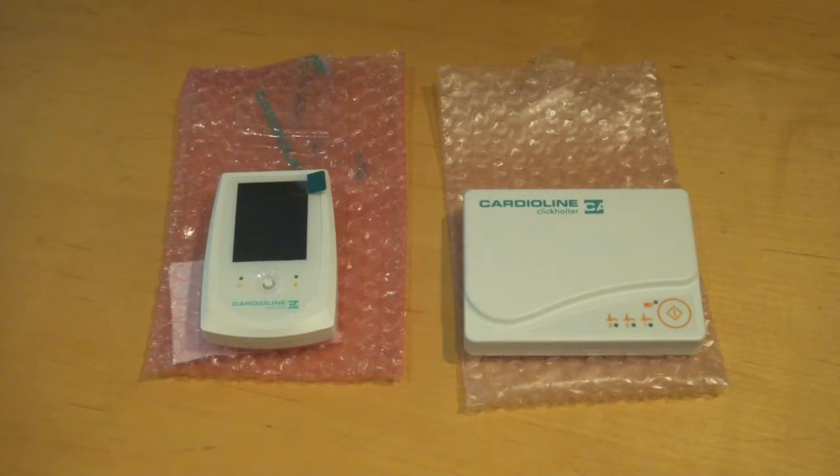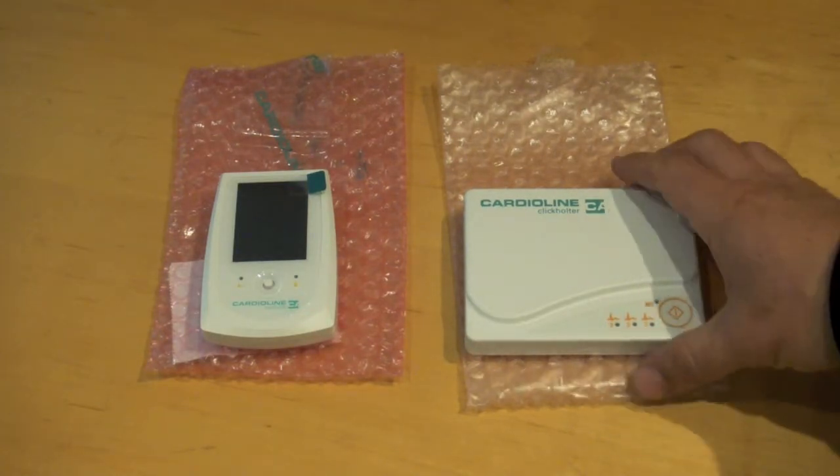Today we'll be taking a look at the Cardioline Holter options available at Cardiac Direct. Cardioline offers two Holter recorders: a more simple recorder without an LCD preview screen, and a more advanced recorder called the Walk 400 Bluetooth. Let's take a look first at the Click Holter.